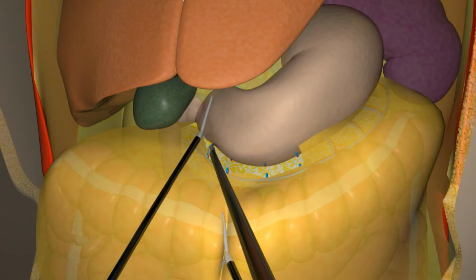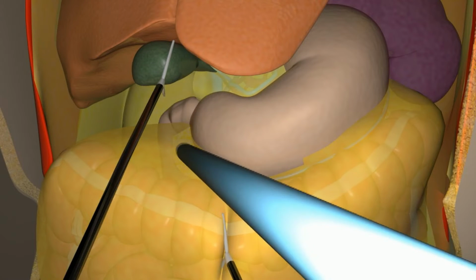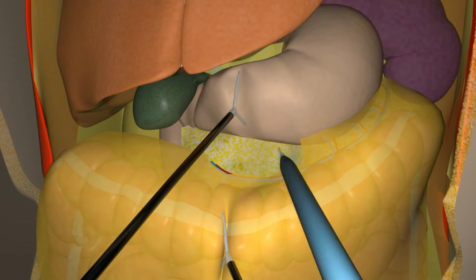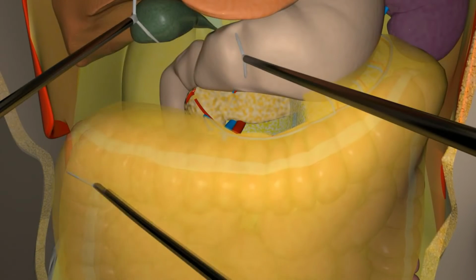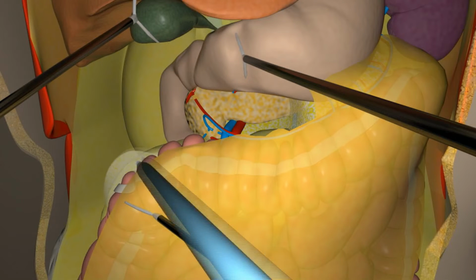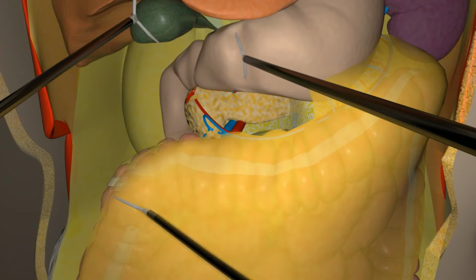As the gastrocolic ligament is divided, the area of retroperitoneal dissection, the gauze, duodenum, and pancreas becomes apparent. The removal of the potential lymph nodes around the origin of the right gastroepiploic artery can be achieved by central ligation of the vessel, which is a branch of the gastroduodenal artery, which is now ligated.